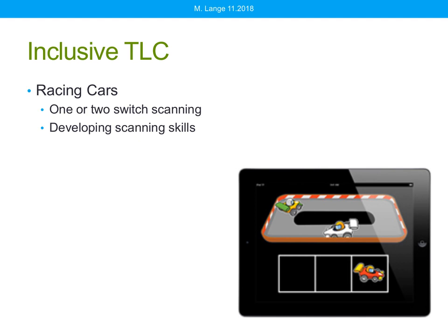Racing Cars is another really fun app for a lot of little kids. Lots of little kids go through quite the cars stage. This works on 1 or 2 switch scanning, which is a nice option, and really is designed specifically to develop scanning skills. So here I can scan through to choose the car that I want to race, or choose the 2 cars that I want to race. I can start the race. I can do a lot of fun things, all with this app.